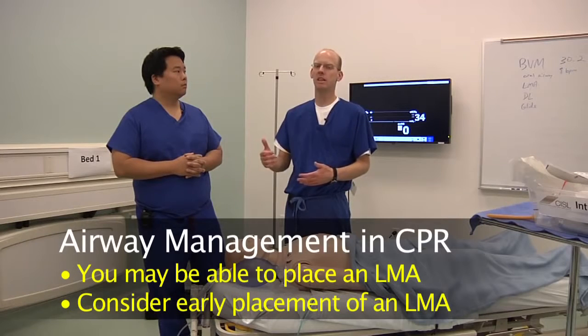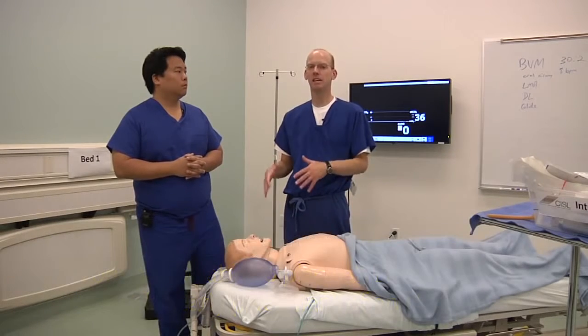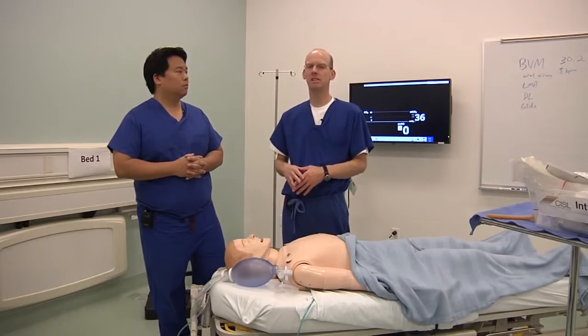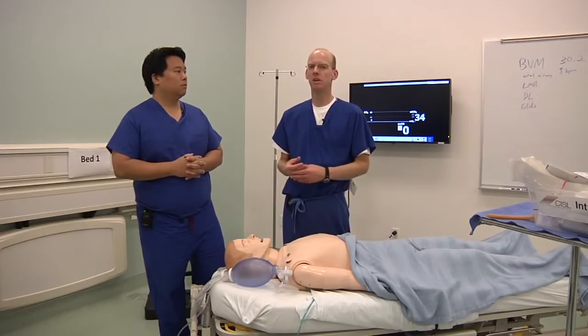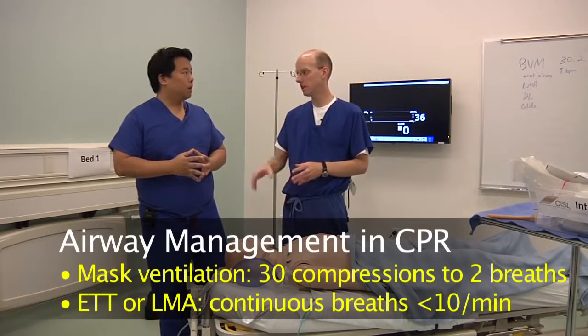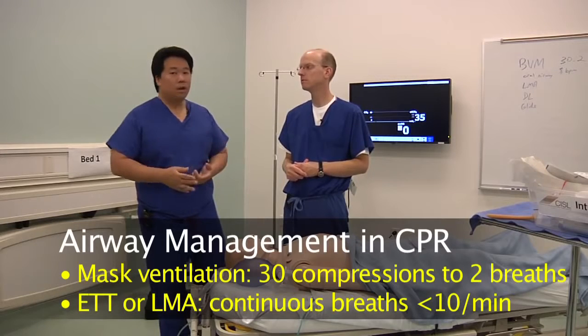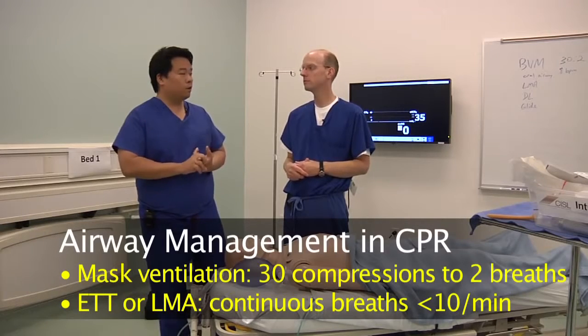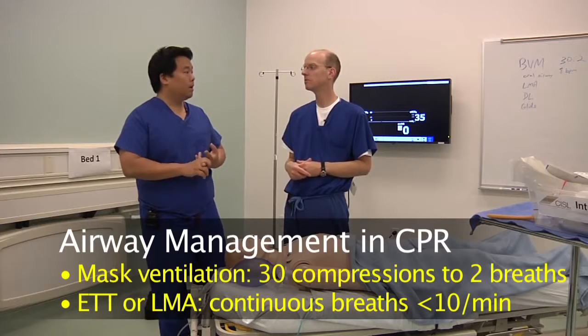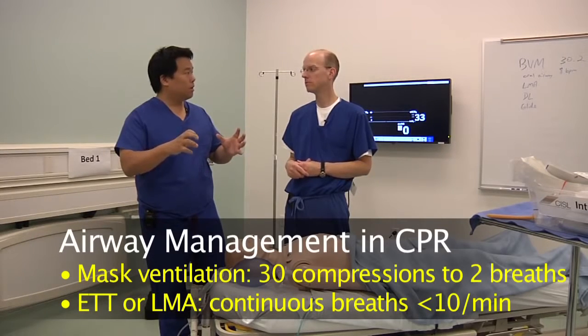You can then do continuous compressions and ventilate at the normal reduced rate of 6 to 10 breaths with an LMA, just like with a tracheal tube. If you're doing bag mask ventilation, you still need to coordinate the 30 to 2. So it's 30 chest compressions to 2 positive pressure mask ventilations. But if you do an advanced airway technique, or you are able to secure the airway with a tracheal tube or a laryngeal mask airway, then you can give breaths during chest compressions.